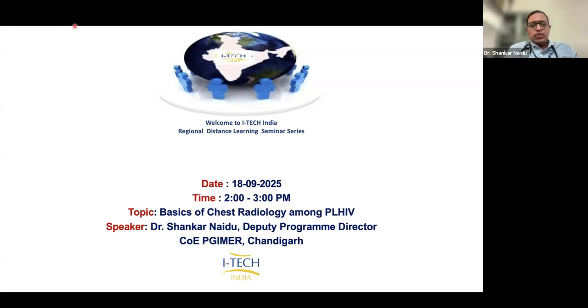Yeah, thank you, and good afternoon, everyone. In today's session, we are going to revise most of the things that all of us know, the basics of chest radiography, and speak about how it is important in our day-to-day practice in our PG centers.